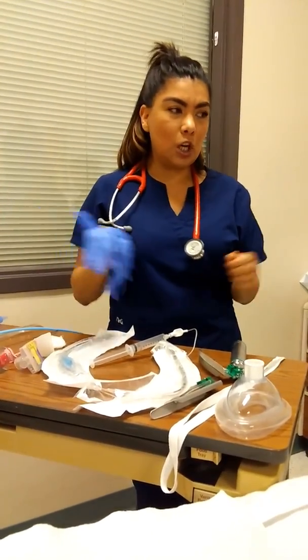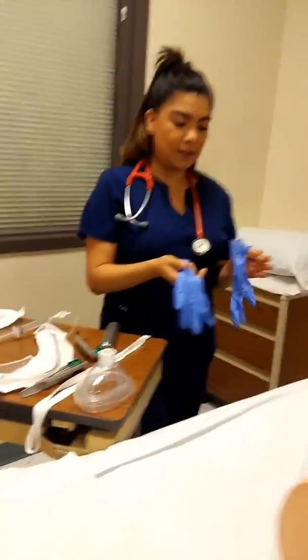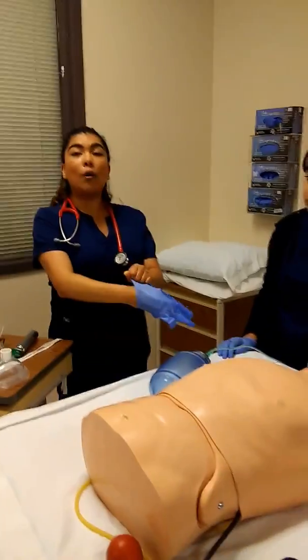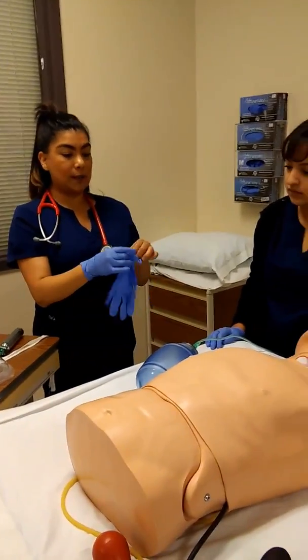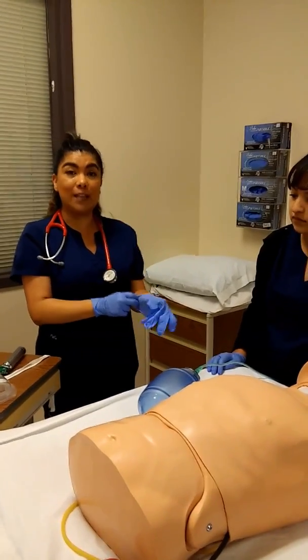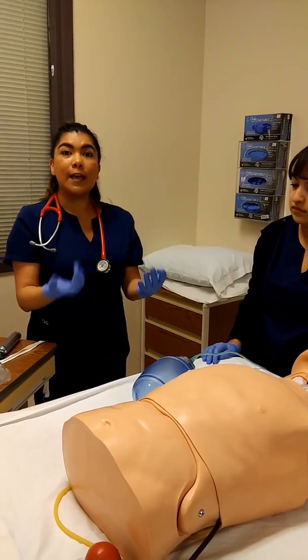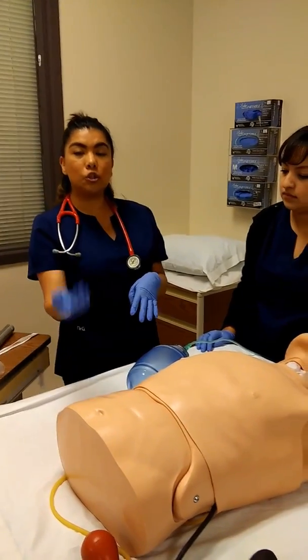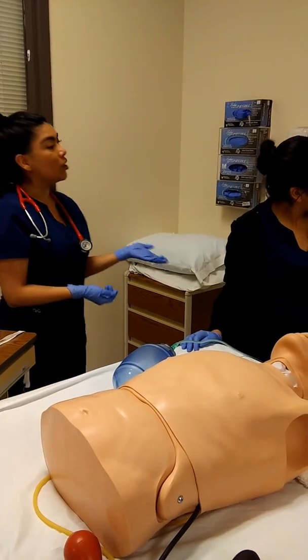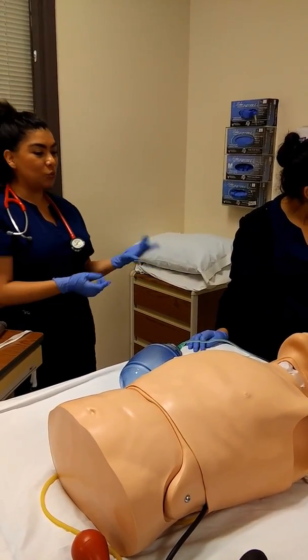So I'm going to knock and identify myself. Hi, my name is Mickey. I'm a respiratory therapist student. I want to make sure that I have the correct patient. If the patient has not yet been sedated, I'm going to ask them to state their name and their date of birth. If they are sedated already, I'm just going to check their wristband again for their name and their date of birth. I'm going to acknowledge any family members that may be in the room.